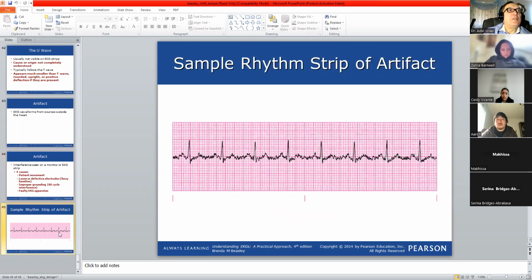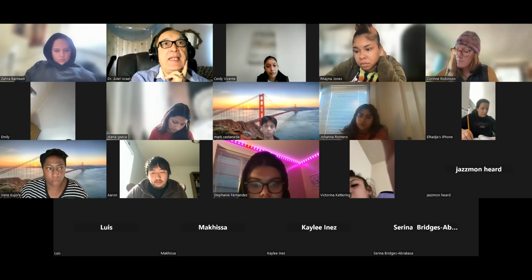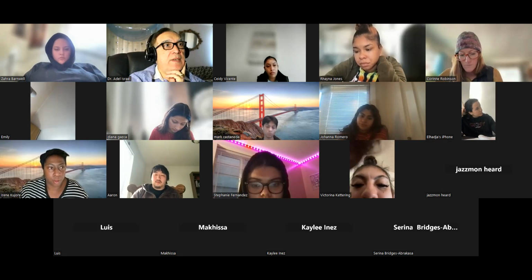Here, look, we had this before, you remember? This is like what happened before with one of our students, she felt cold, and this cold is making these fine waves. It is not related to the heart waves. I hope everything is okay for today's chapters 5 and 6. And of course, if you have any question, you are so welcome.